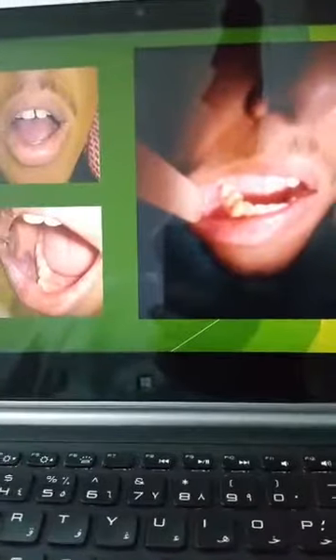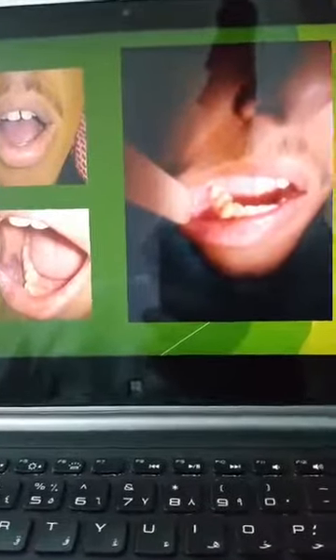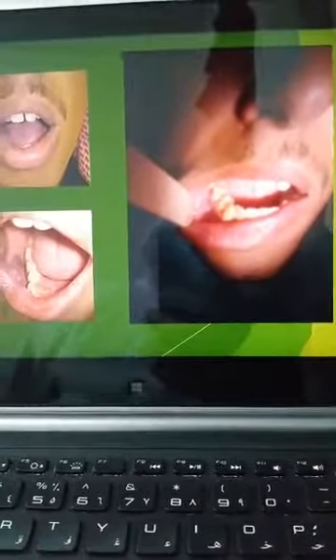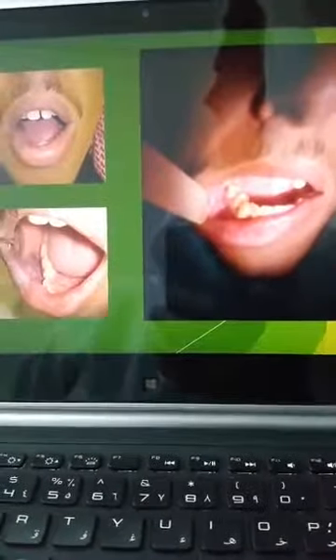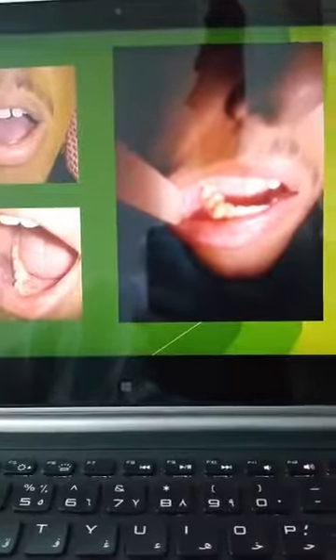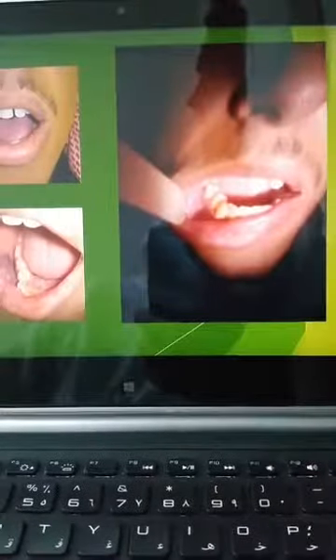Hemangioma, this is a beautiful thing that we learned from laser, and I think laser is a blessing from Almighty God that we can cure patients without any invasive surgery, by applying the fiber with what we call the interstitial technique, and the patient can be treated in the chair without changing the structures.